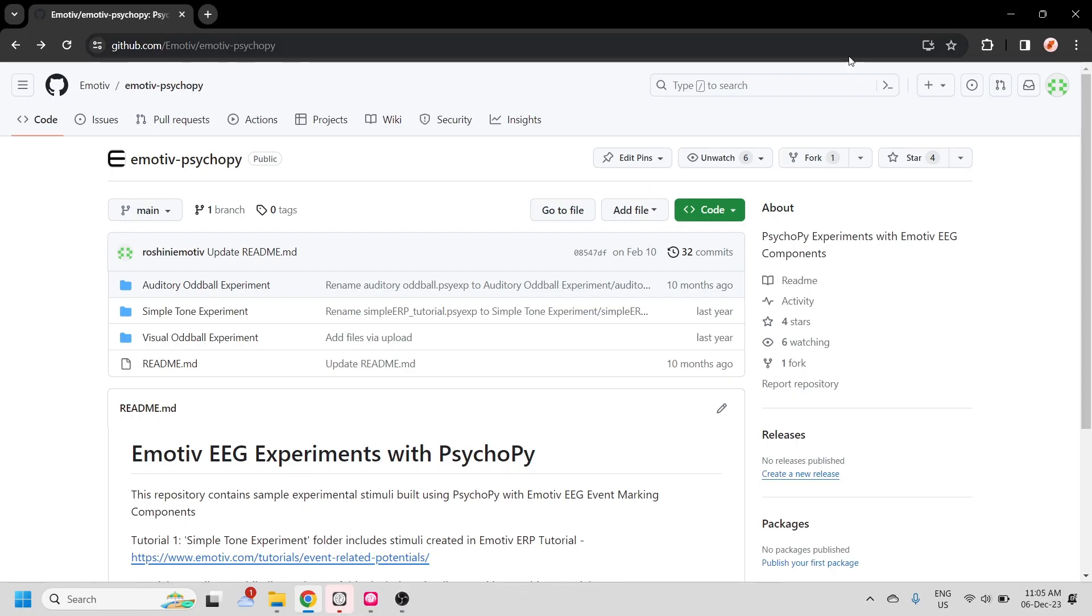You can find some of our sample experiments on the Emotive GitHub page. You might find that some of the experiments are built with older versions of PsychoPy. You might need to replace the marking and recording components in the newer versions.